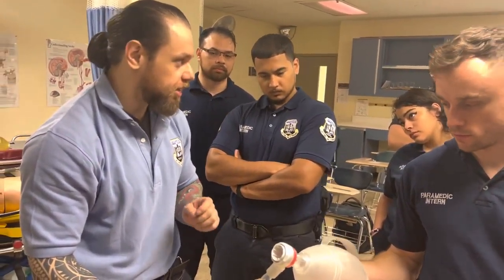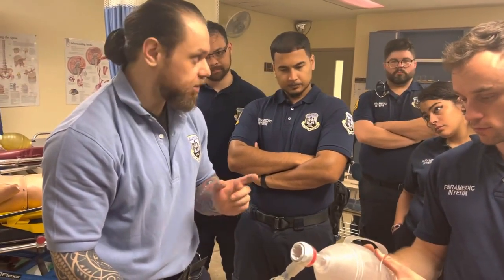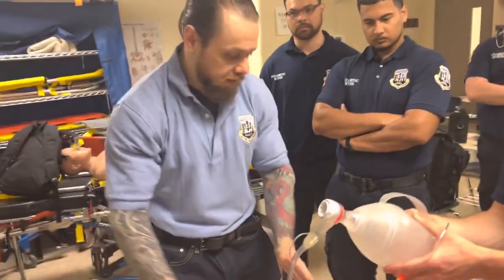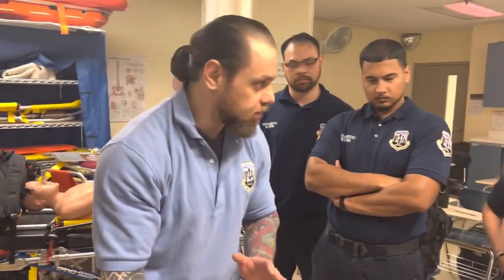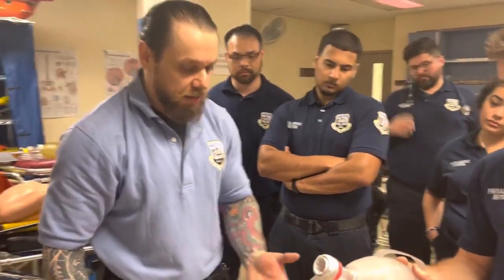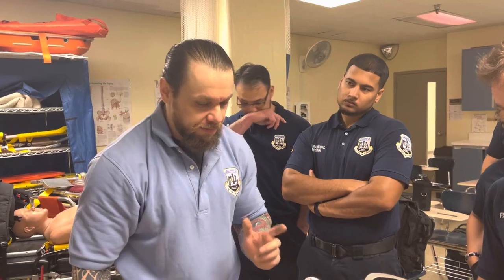You want to make sure everything is in place, right? You guys have any questions about anything? Clear, right? So his job, you saw, holding the earmuff technique, he doesn't let go until the collar is back on, right? I kind of did the procedure quite fast.